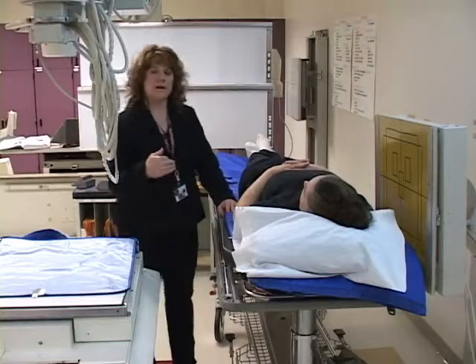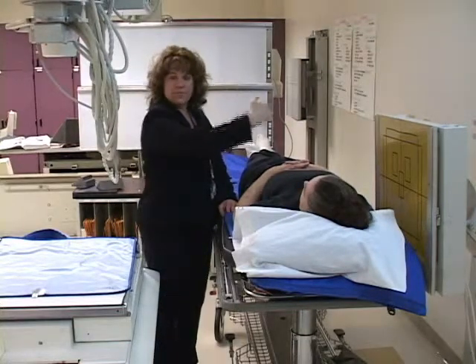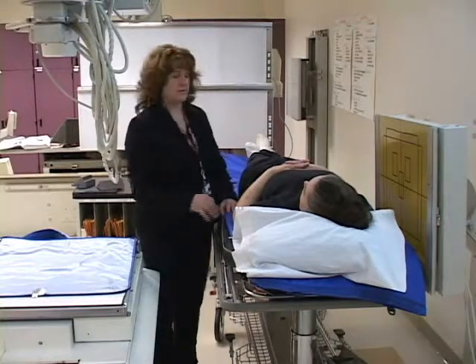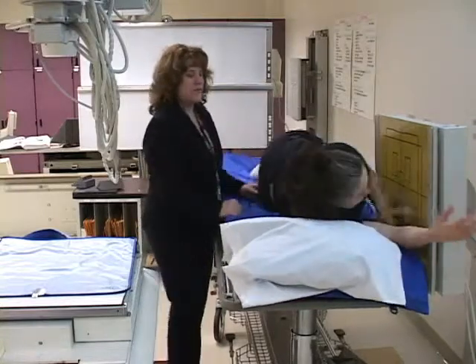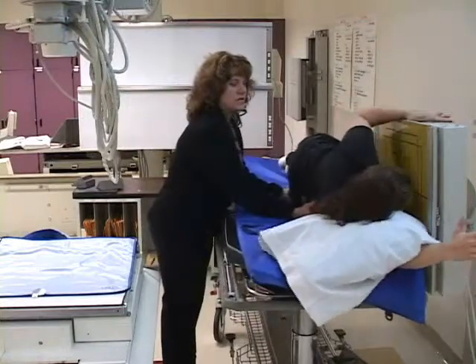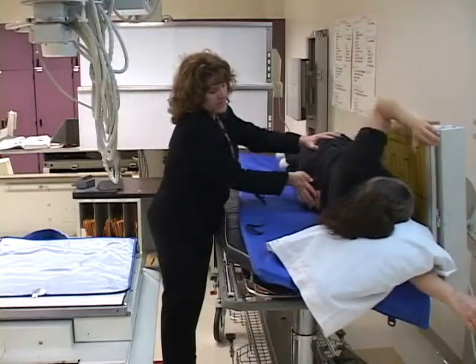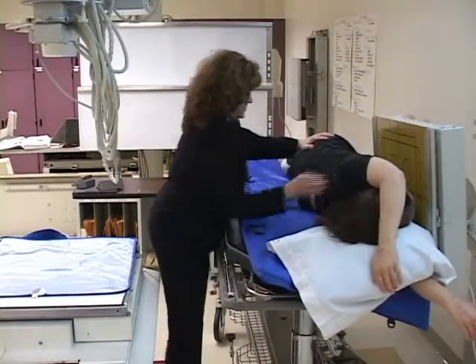For this one, the radiologist has asked me to have the patient turn away from me. So we're actually going to be doing a right lateral decubitus. So I'm going to have you turn towards the bucky. Okay. I'm going to have the patient get as close to the gurney or to the wall bucky as they can. Okay. I want them to be as lateral as they can. Bring your arm up above your head.